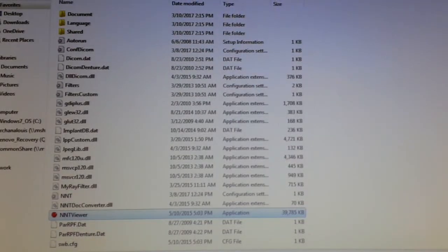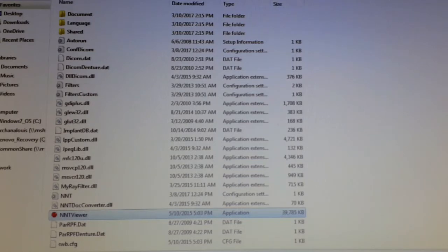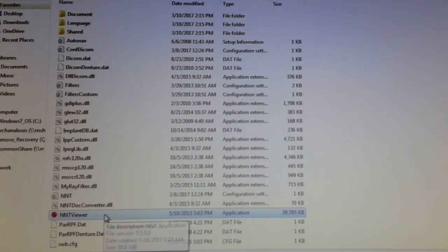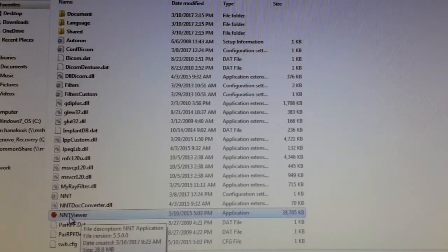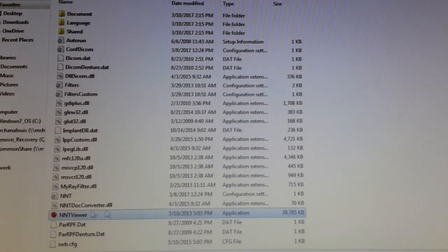When you open your CBCT and put the disk in, it should auto-load or auto-play. If that does not happen, you can go to My Computer, open the CD, and click on the exe file — this is the NNT viewer in this case. Double click on it.